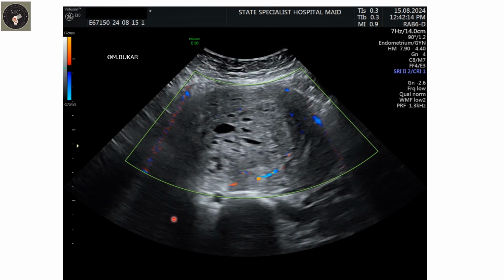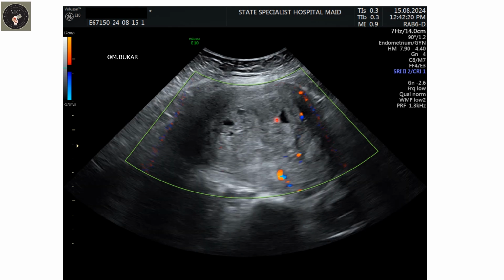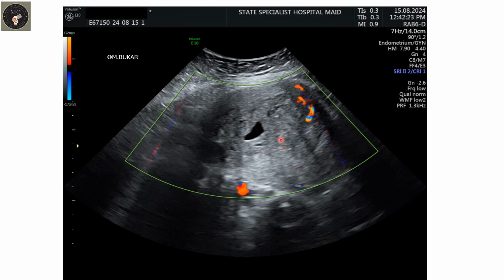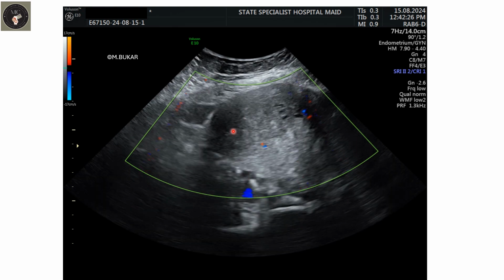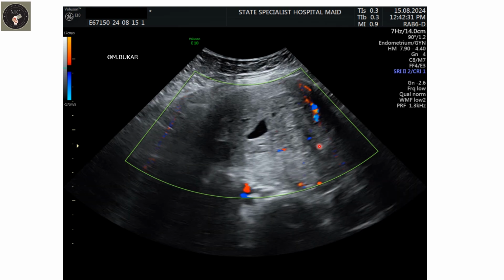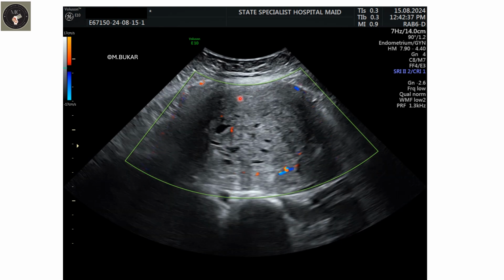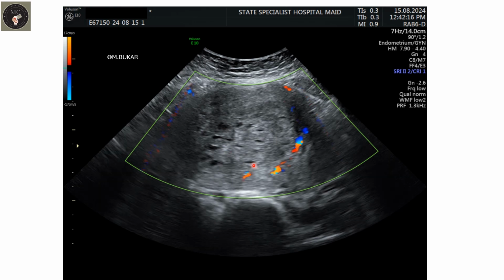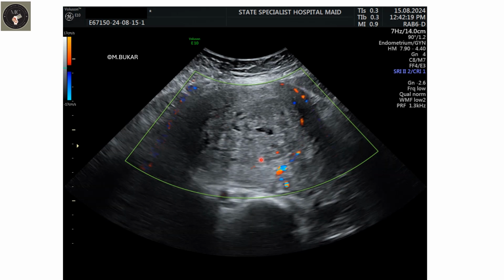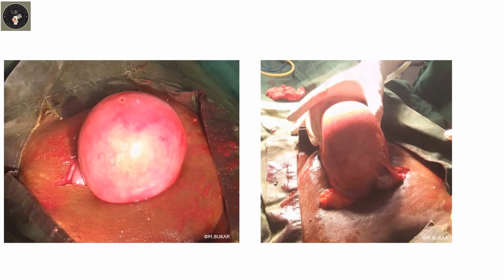So remember, a uterine fibroid has peripheral flow, or can have both peripheral and central flow if the fibroid has undergone degeneration. Here you can see these are part of the arcuate vessels. This is the myometrium, and note the clear demarcation between the myometrium and this lesion. There is circumferential flow to the fibroid here. So this was the large fundal fibroid that had undergone degenerative change.